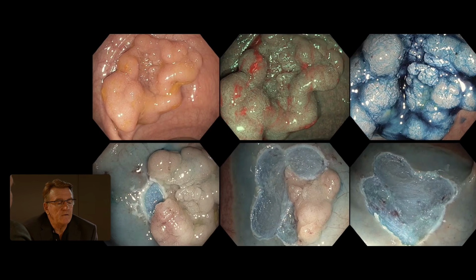And then when we look carefully with NBI, we don't have a near focus image here, unfortunately, but in overview we see some depression, and then in near focus, we see the pit and vascular pattern, and it's still homogeneous. You can't see anything of great concern there.